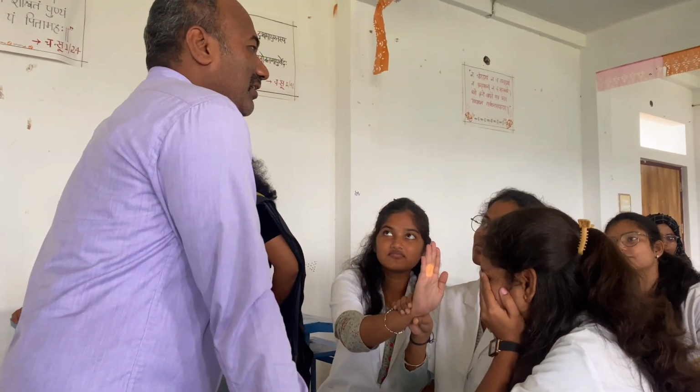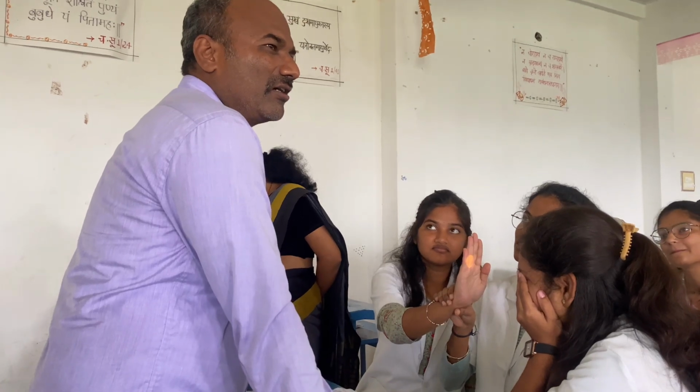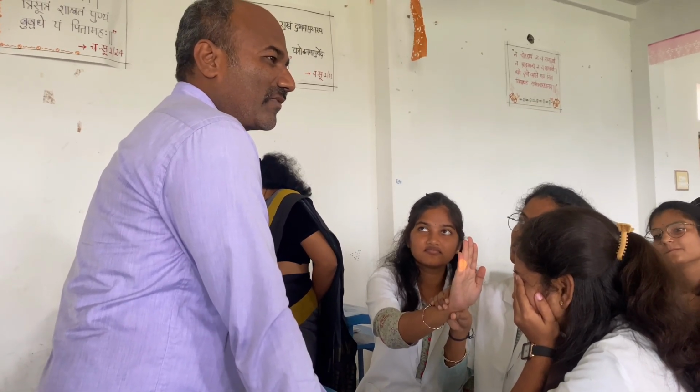Adjust the lenses as good as the fine tuning of a camera or microscope accordingly, right?